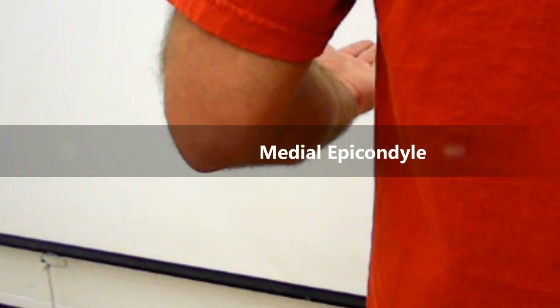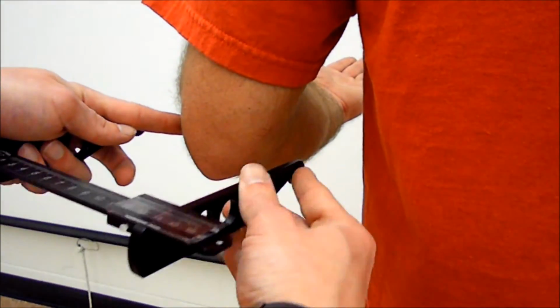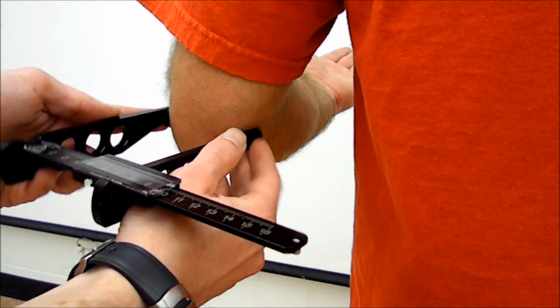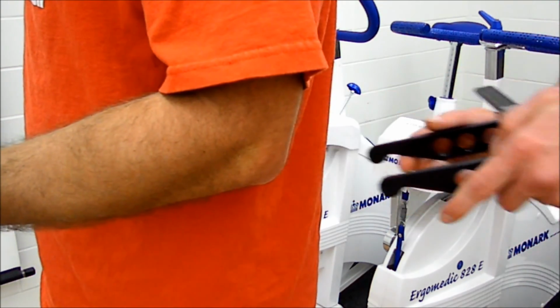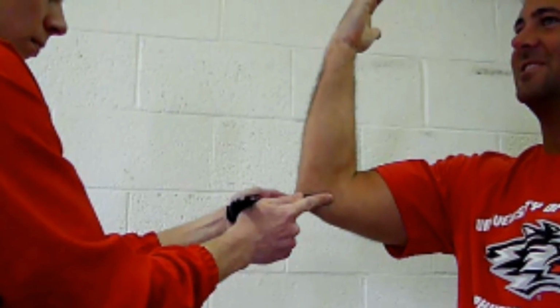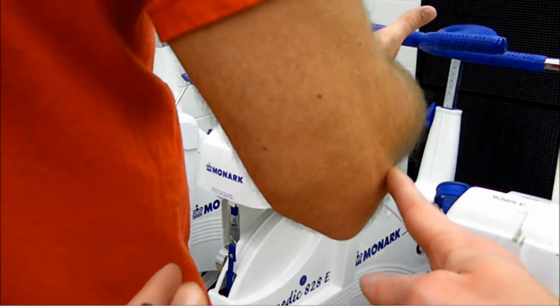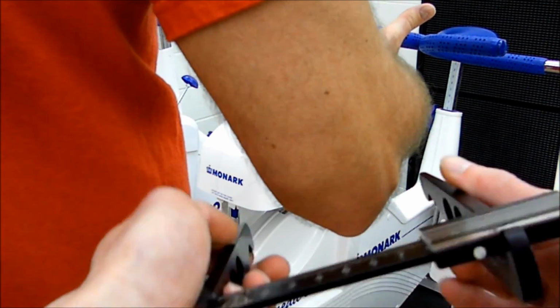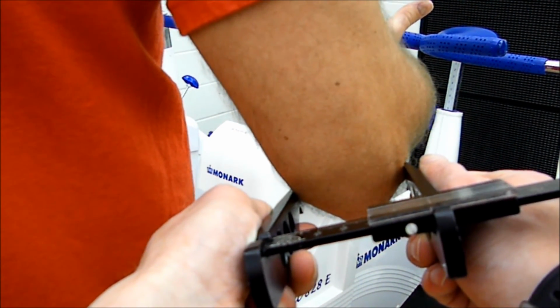The anatomical reference point for the elbow skeletal diameter measurement are the epicondyles of the humerus. The participant should flex their elbow to 90 degrees and the forearm supinated horizontal to the ground. Depending on the client, it may help to have the client move the upper arm to a horizontal position with the forearm at a 90-degree angle vertical to the ground. The calipers will be applied at an oblique angle so that the tips of the caliper contact with the medial and lateral epicondyles of the humerus.